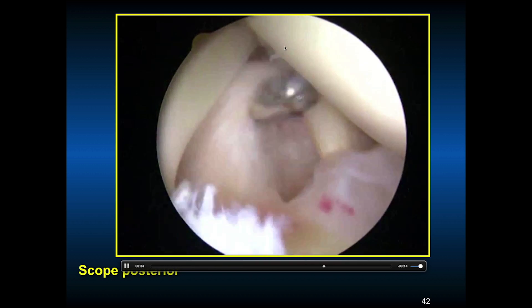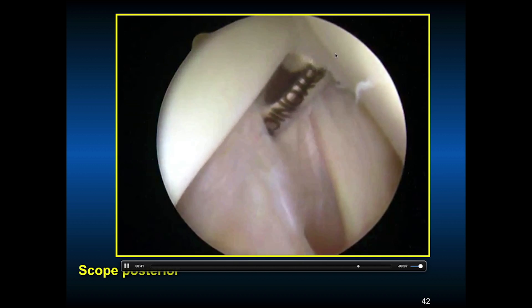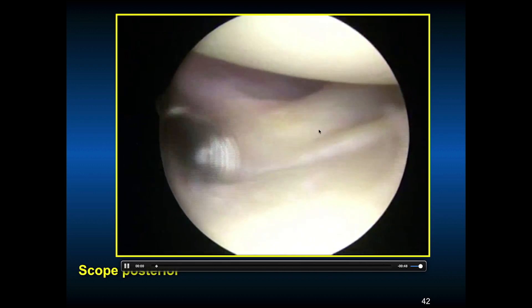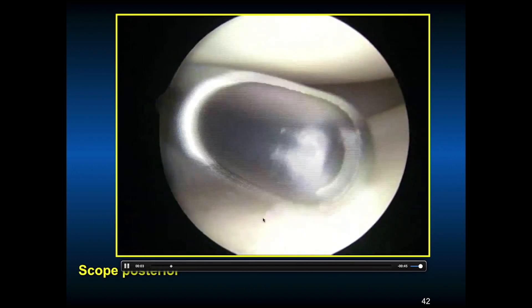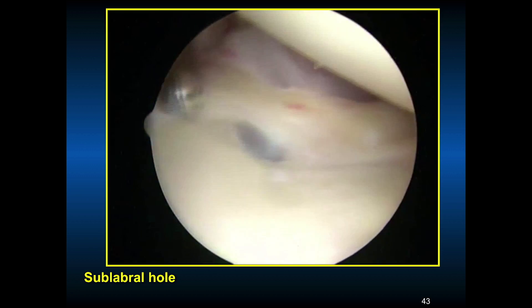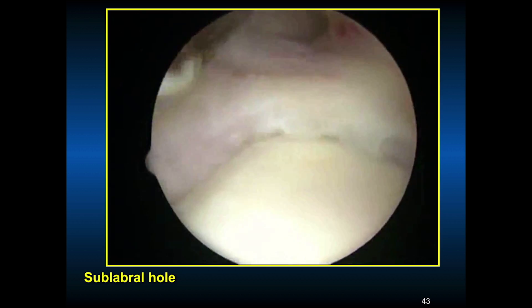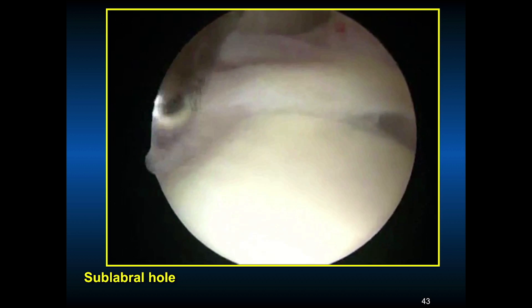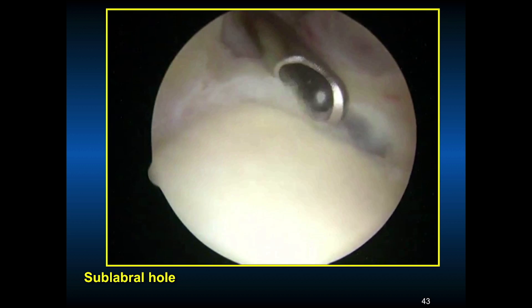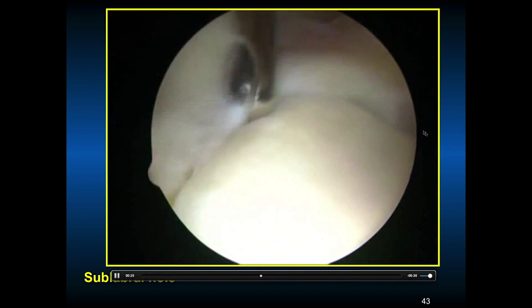You can see the anterior inferior glenohumeral ligament and the labrum. Her tissues look much different than the first case — tissues can differ based on chronicity or the genetics of the patient. There's the subscapularis. She had a small 10% subscapularis tear. You need to use the 70-degree scope to identify this, and this was the upper 10% at the insertion of the subscapularis. A sub-labral hole is a normal variant seen in about 10–15% of patients. If you repair it, it's not going to work — you'll over-constrain the shoulder and they'll get stiff.